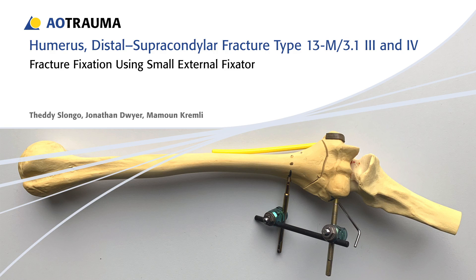In this exercise, the small external fixator will be used for the fixation of a supracondylar distal humerus fracture, AO types 13-M, 3.1, 3 and 4.